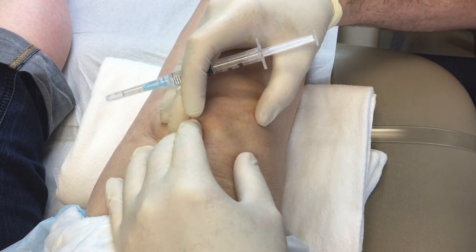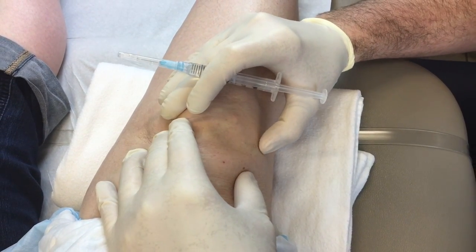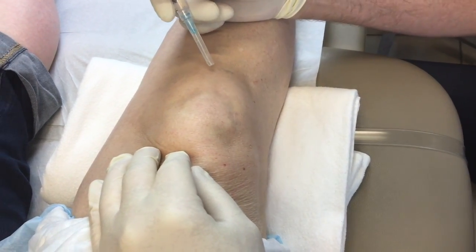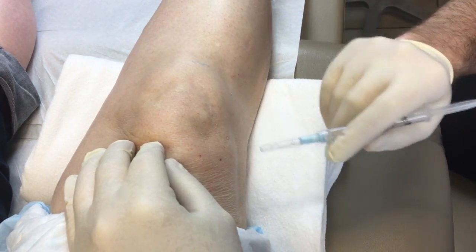You can usually blot beneath the patella and shift it open. When I do the injection, it'll raise the patella up and we can inject underneath it. You can also inject anteriorly as well — we're not going to do that this time, but I can show you that on another injection. This is the spot we're going to be looking at.